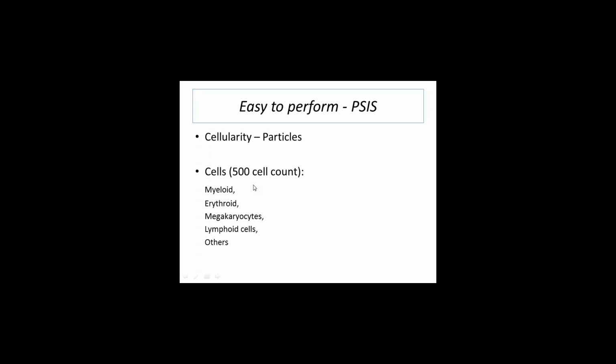In an aspirate, it comes with time. If we see a larger number of cells, if the particle is very cellular, we can say that the cellularity is adequate. Or it is mildly diluted or fairly diluted, which are the terms we can use. We should never give a percentage on an aspirate.